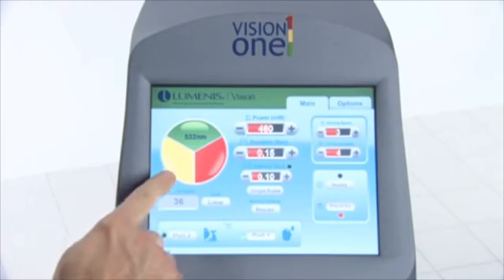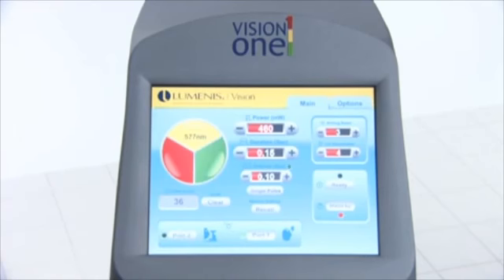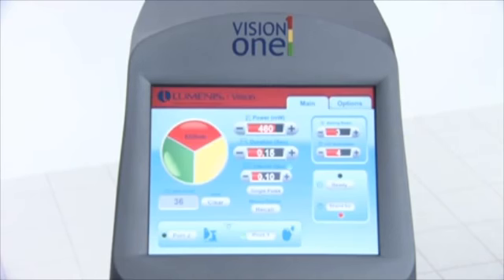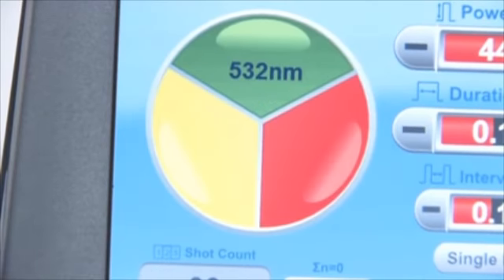To select the laser treatment color, press the desired color on the color wheel. Uninstalled colors are grayed out. The selected color rotates into the top position. The color wavelength displays and the color of the bar at the top of the treatment screen changes to reflect the selected color.